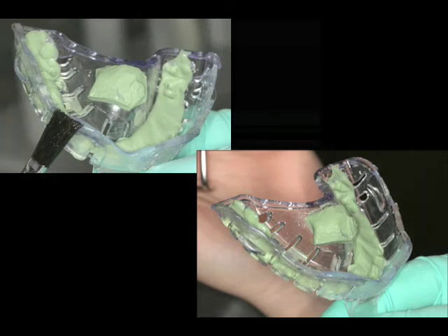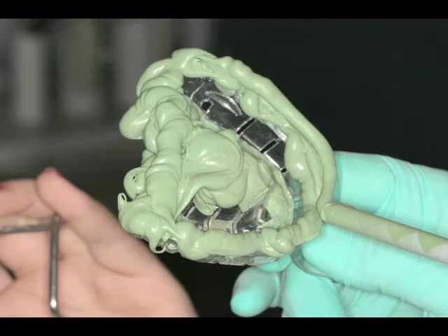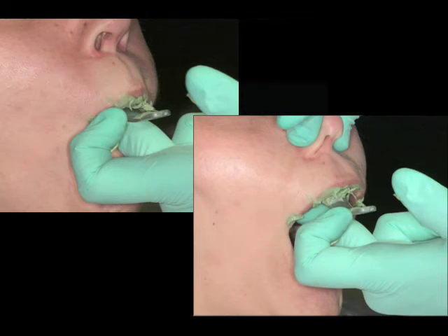We are now going to be placing adhesive around the borders. The next step will be border molding. It is important that you place the adhesive around the borders and in the post-palatal zone. Now I am applying a rigid viscosity polyvinyl siloxane and preparing to border mold. I place this in the patient's mouth and follow the protocol: number one, anterior frenum; number two, I have the patient pooch and then smile to get the vestibular sulcus area, both anterior and posterior. I then take my finger and thumb and pull the cheek out and down. Thirdly, I have the patient open very wide to delineate the post-zygomatic space, then breathe in deep, occlude the nostrils, and forcibly cough to get the post-palatal zone.